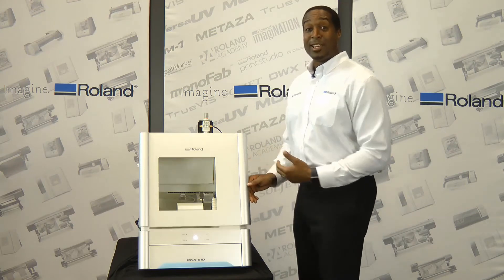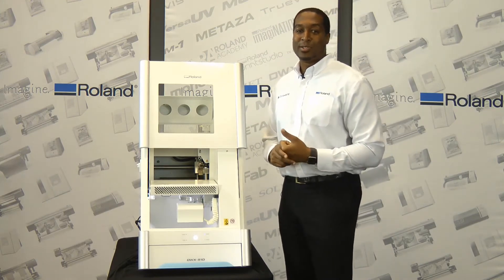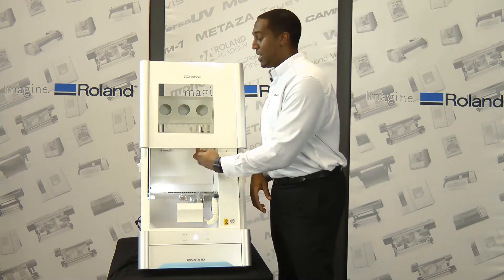This mill has a new ball screw system, and you can see it here, that offers more stability when milling dental restorations. Each axis is covered, protecting the ball screw system from material waste.